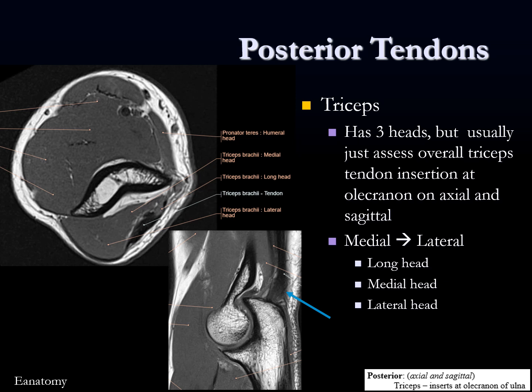Posterior tendons are the triceps — fairly straightforward. They have three heads, but usually we just make an overall assessment of the triceps insertion unless there's abnormality. I evaluate the triceps tendons on axial and especially the sagittal because the sagittal shows the insertion on the olecranon very well. As we go from medial to lateral there are three heads: the long head, the medial head, and the lateral head.